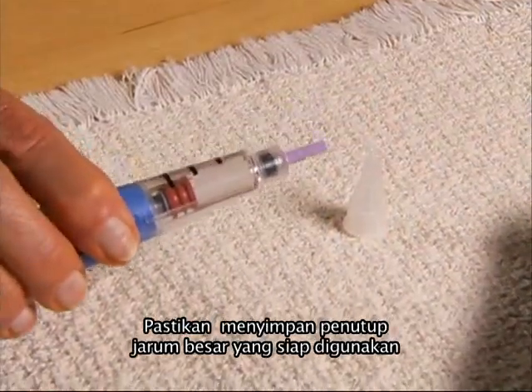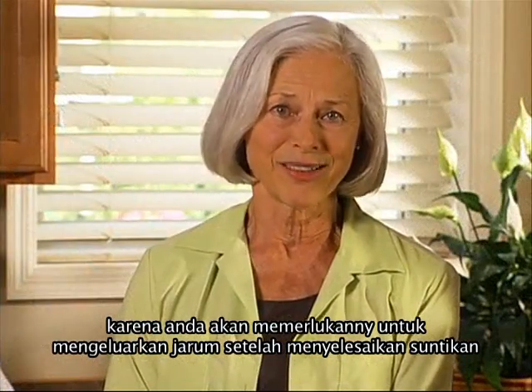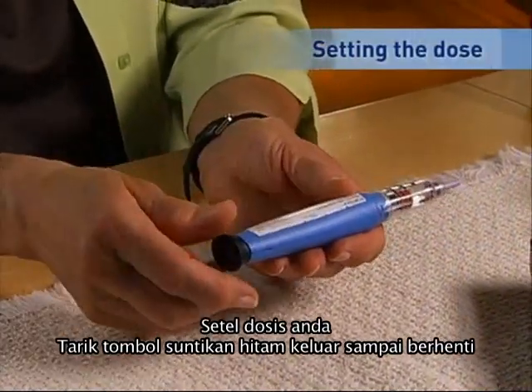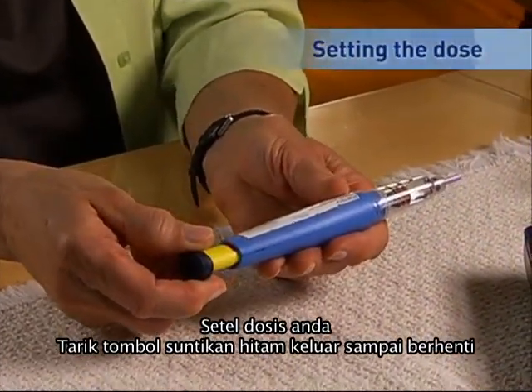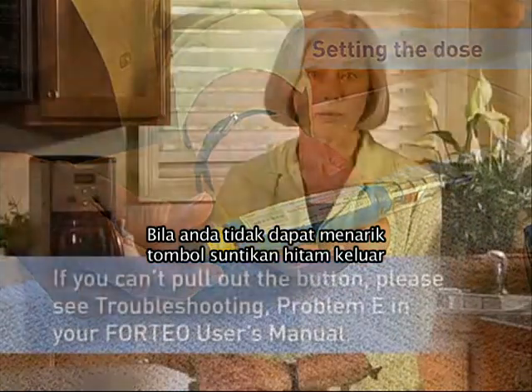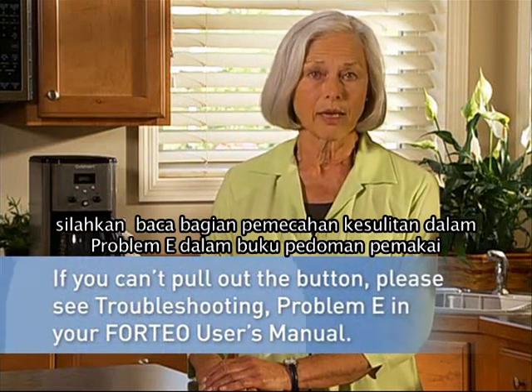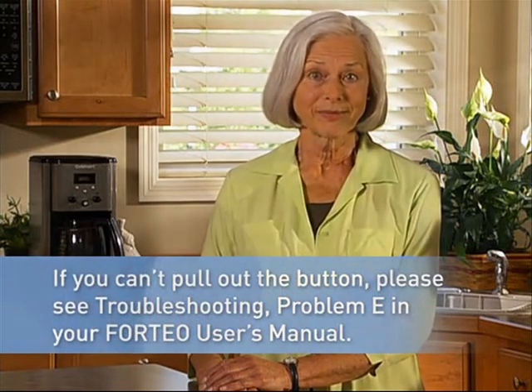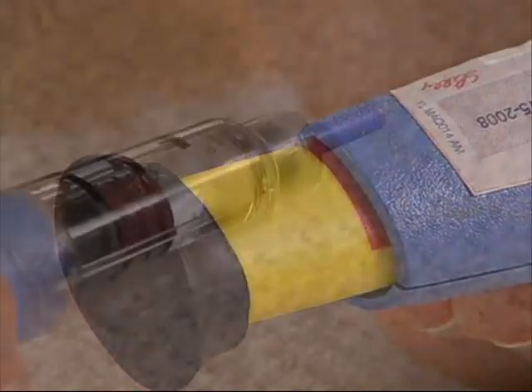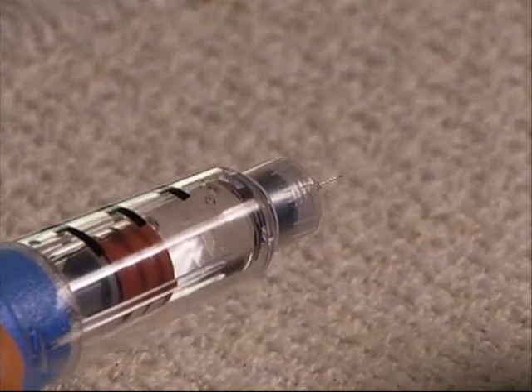Be sure to keep the large needle cover handy because you will need it to remove the needle after the injection is finished. To set your dose, pull out the black injection button until it stops. If you cannot pull out the black injection button, please see the troubleshooting section, Problem E, in your Forteo user manual. Check to make sure you see a red stripe. Pull off the small needle protector and throw it away.